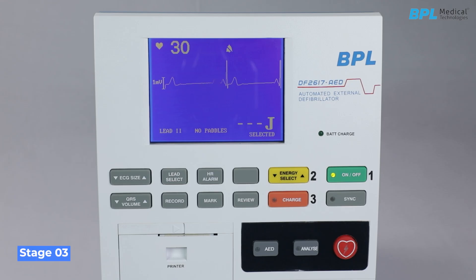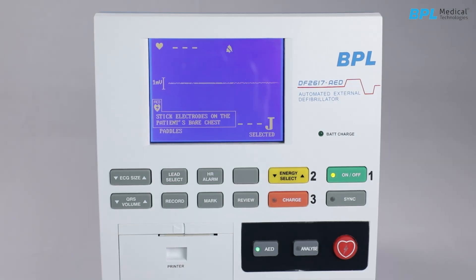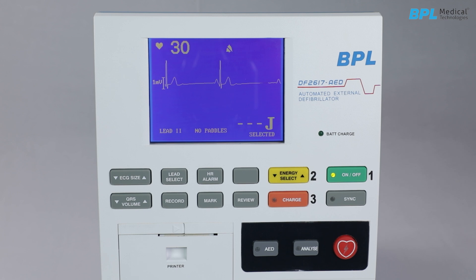Stage 3 — Shock: The AED analyzer will determine the necessity of a shock and advise the user to apply it. The AED will charge to the set energy level. The red LED inside the shock key will be flashing. The shock key continuously blinks to draw the user's attention. Before pressing the shock key, ensure that no person is in contact with the patient or any material in contact with the patient. The user should then press the shock key to deliver the shock.